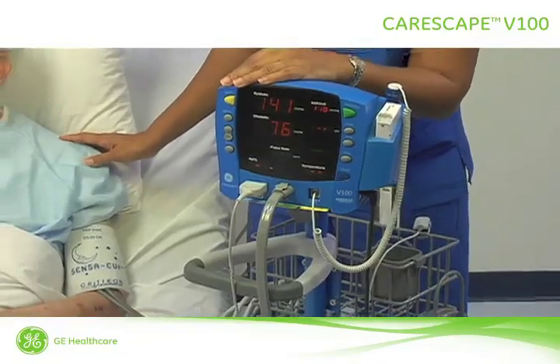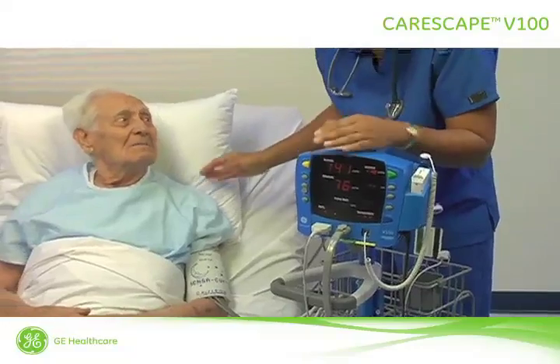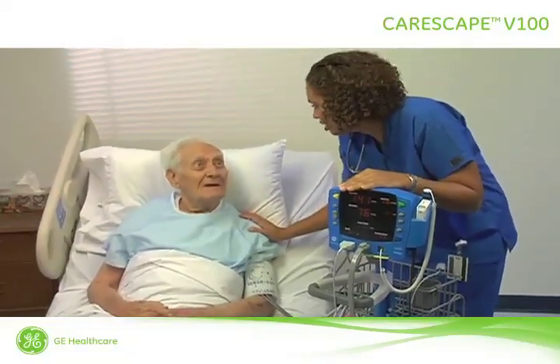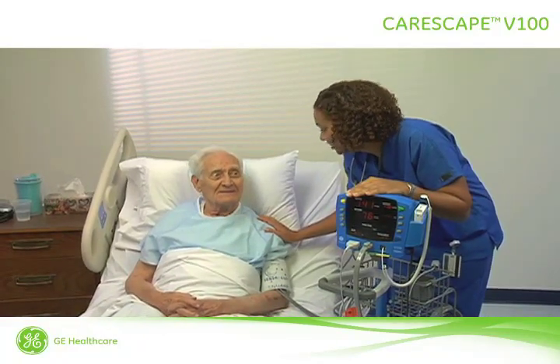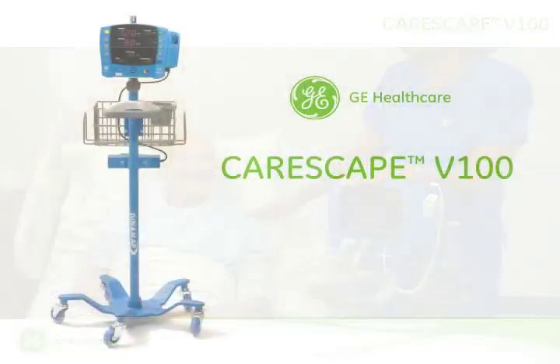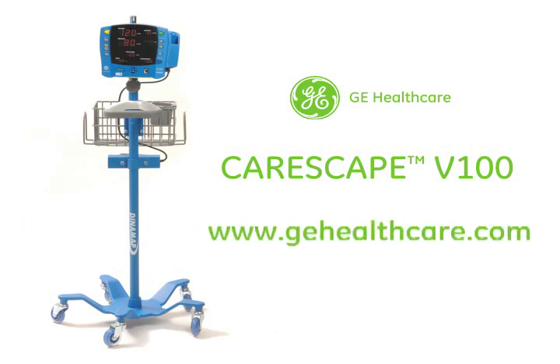The Carescape V100 delivers the speed, accuracy, and mobility you require when capturing patient vital signs. By integrating vital patient data into a seamless record of clinical intelligence, the Carescape V100 enables you to access the right information at the right time and place, helping you improve provider performance and patient outcomes. If you have any questions or need more information, please contact your local sales representative or visit us on the web at www.gehealthcare.com.